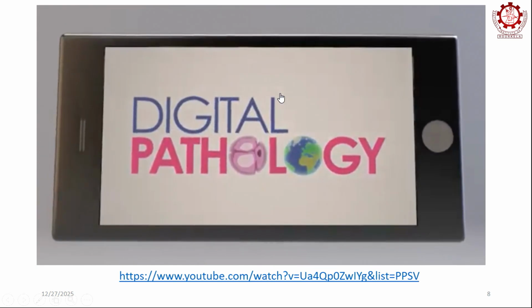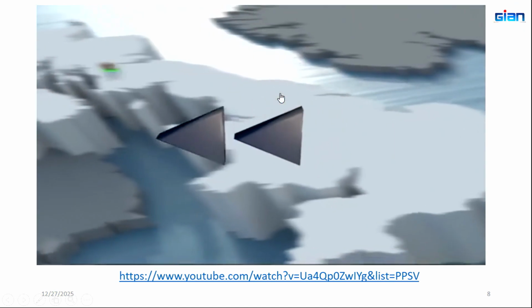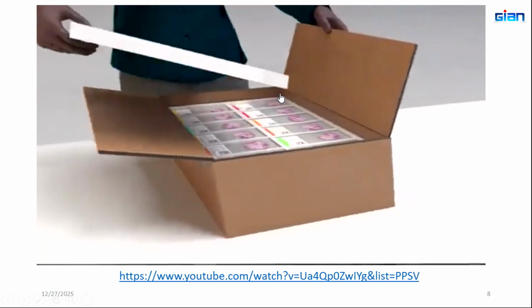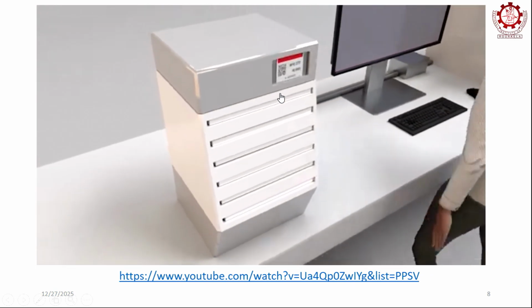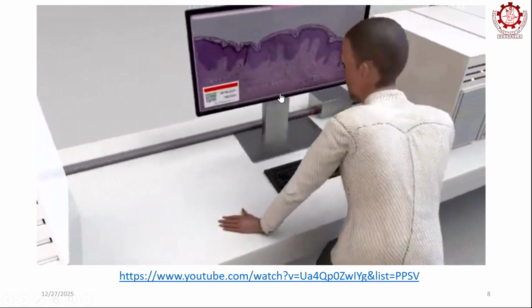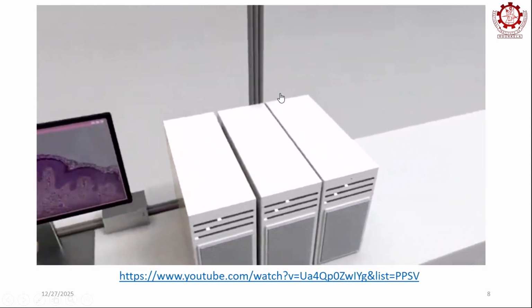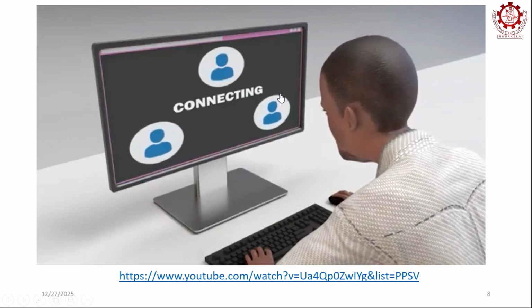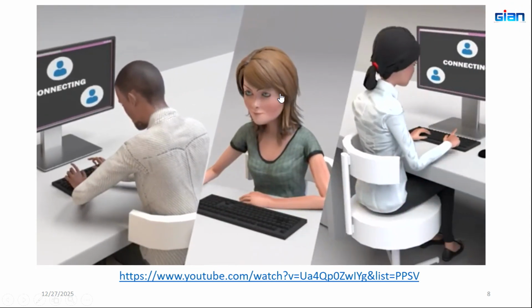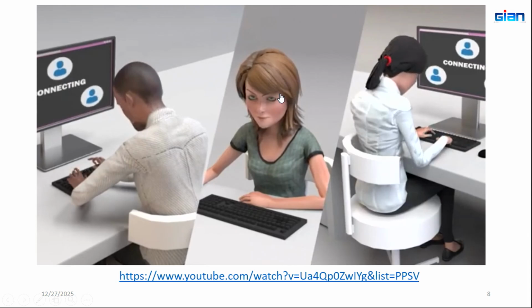Digital pathology. If we go back to where we started, instead of the tissue sample being packaged and sent away, the sample is digitally scanned and uploaded onto a secure server, where only verified pathologists can access it. The easy accessibility means that other pathologists can come together and collaborate in giving their opinions and suggestions.